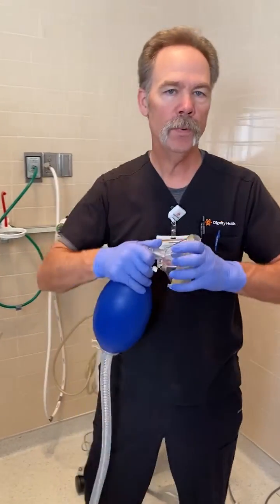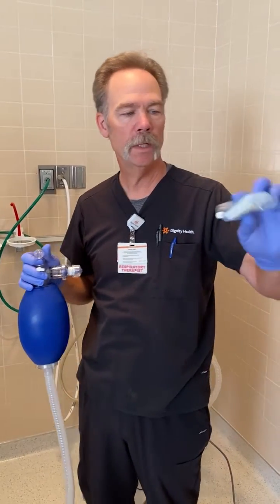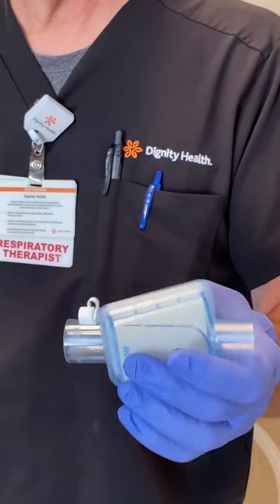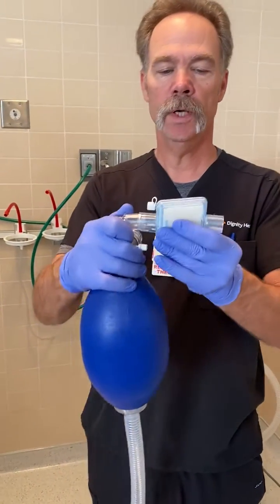This is the important part. You want to put an HME on here. We call this an HME — heat moisture exchanger and filter, high-particulate filter, viral filter — and it just goes on.